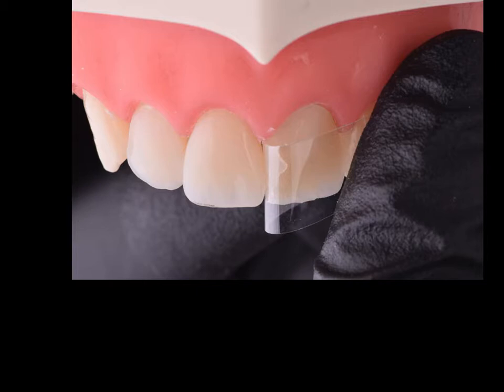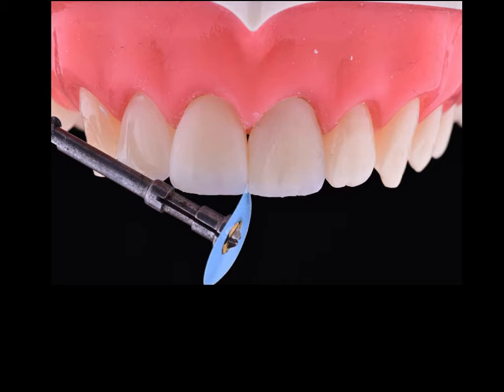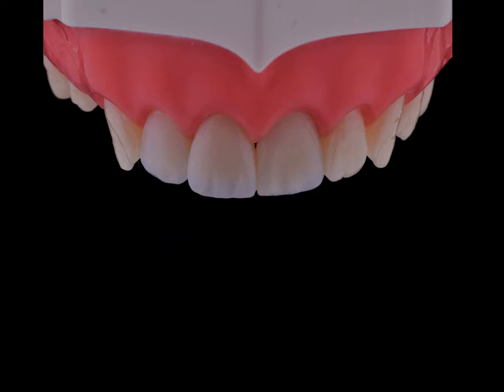And with your cellulose strip, you will pull them distally and then correct it with a disc. Look at the beautiful natural result you got with the three layers. You don't have to do three layers today, the composite. They are very natural. They have chameleon effect.